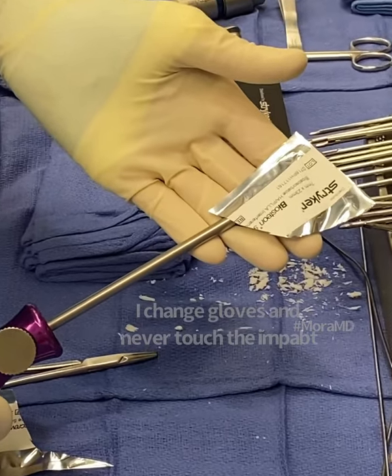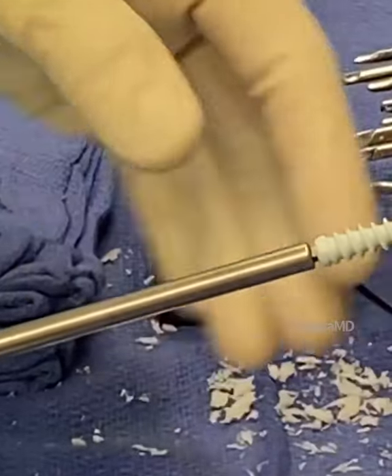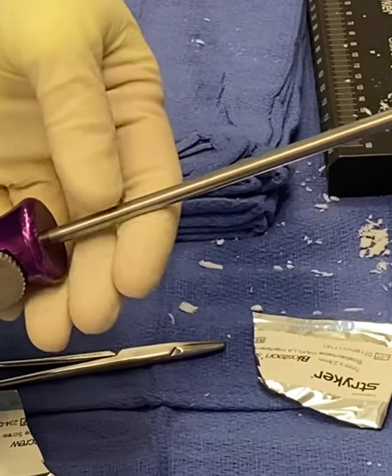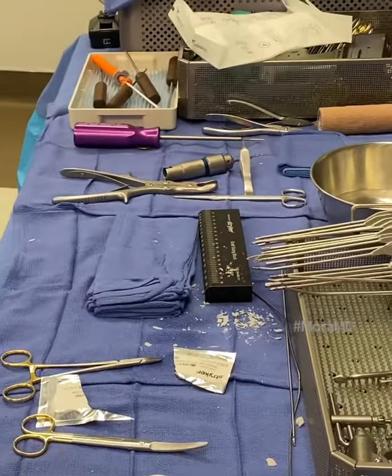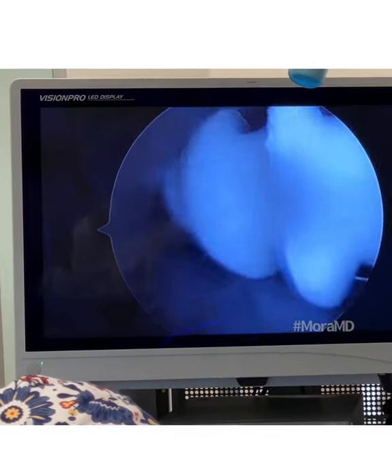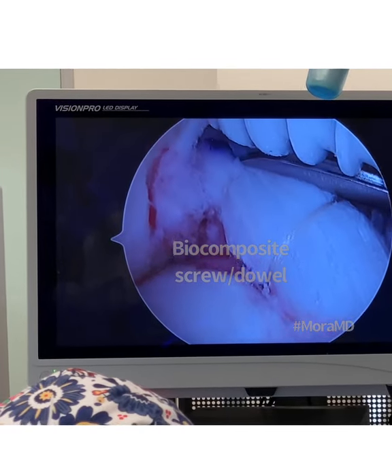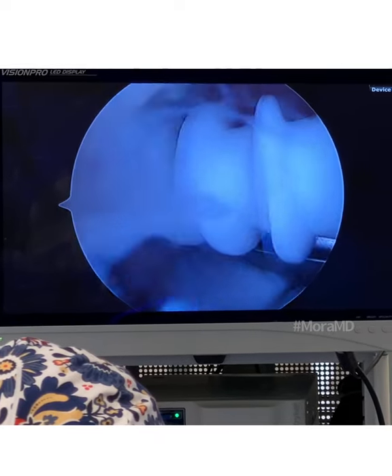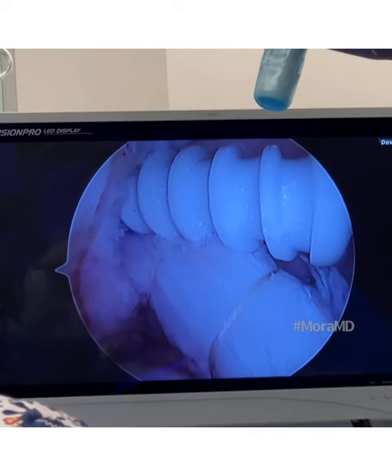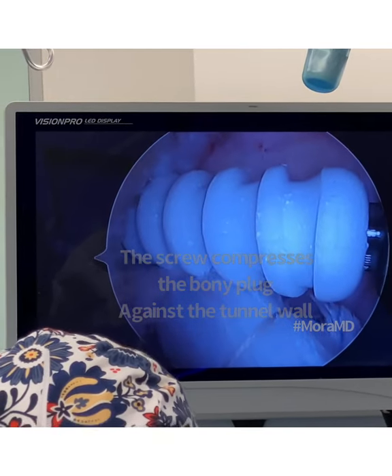I'm using a Stryker Bioskion interference screw — it's basically like a threaded dowel. I actually don't like to touch my implant before I put it in; I got new gloves on as well, just to decrease the risk of infection. Sneaking my little screw in there, making sure I have the right angle, protecting my graft with that little protector. The screw will hold the graft up against the bony tunnel, compressing it, and over time it will heal into the bone — and this screw will disappear.